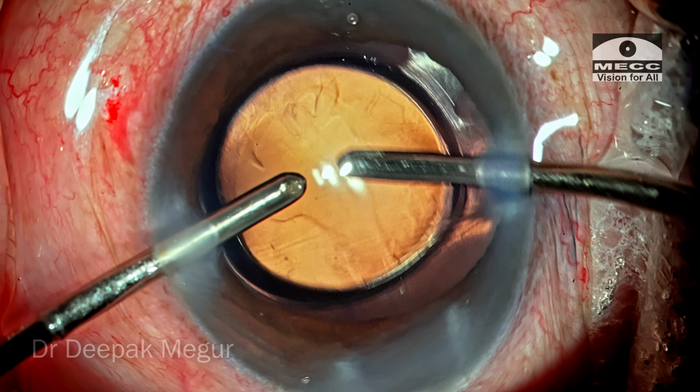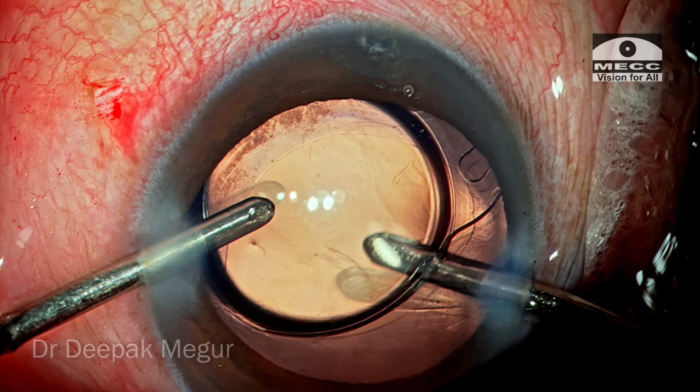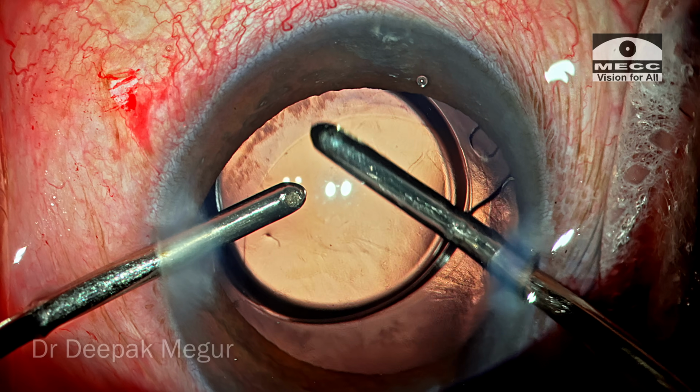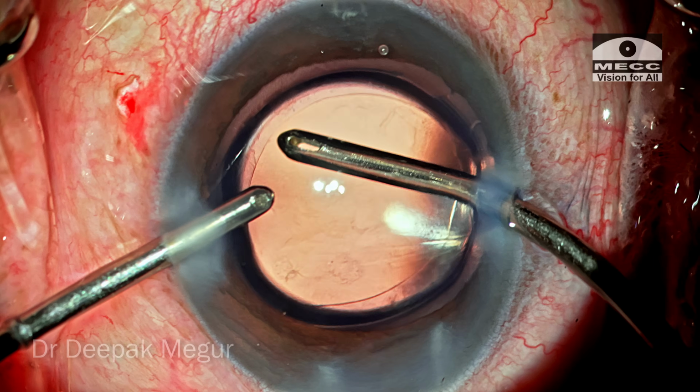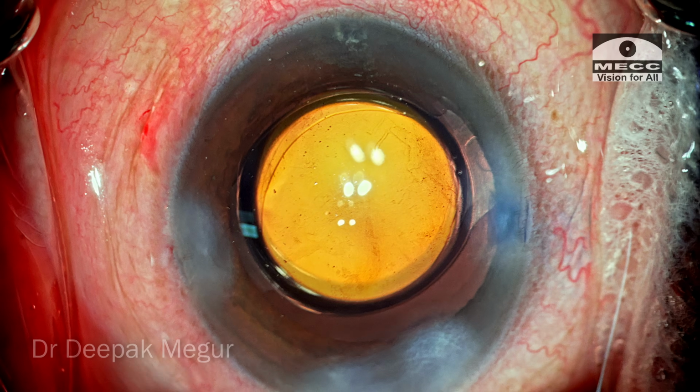So once the lens is gone inside, it's time to remove the OVD both in front and behind the lens. I'm going to just irrigate out the OVD. It takes a couple of minutes and that's it, the job is done. So the wounds are hydrated, the case is complete.